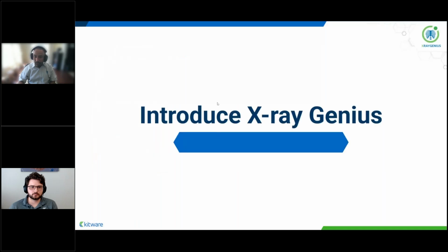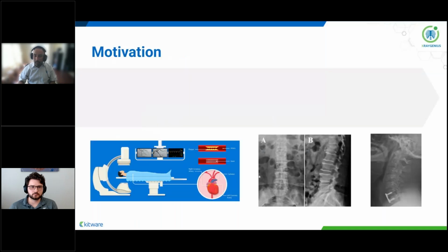All right, so let's talk about the motivation behind X-ray Genius. As a lot of you know, X-ray imaging for diagnostics and screening purposes, especially for lung cancer and other respiratory diseases, is widely available. So there's no lack of accessible data for that type of application.